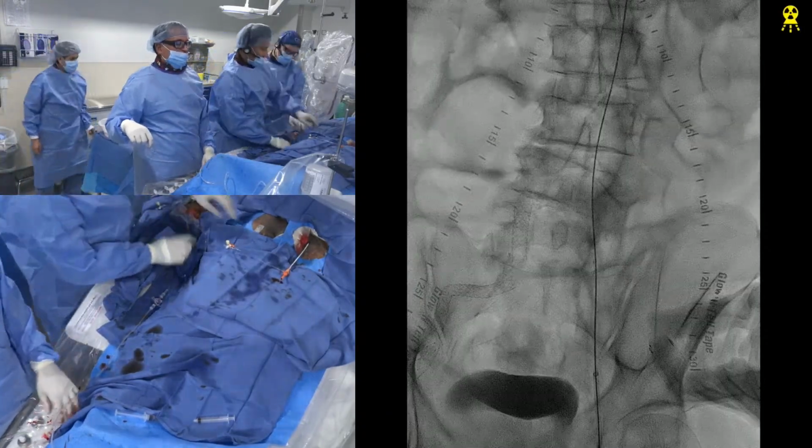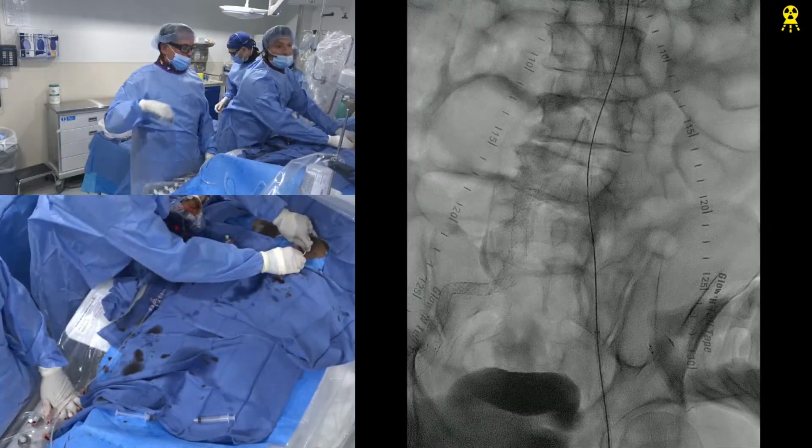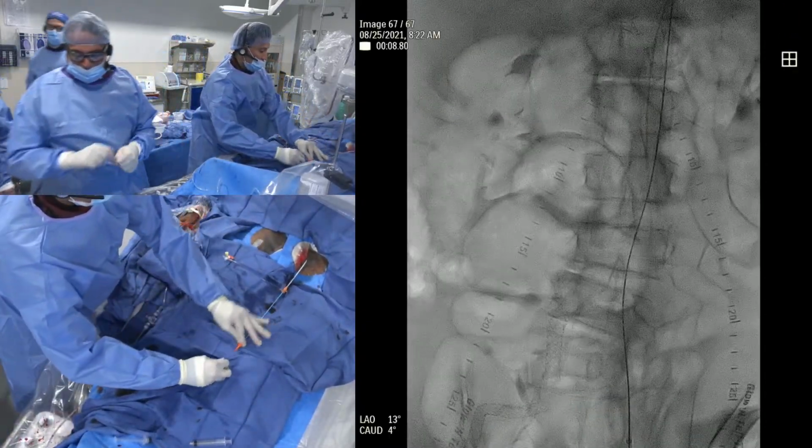Type that down, please. I kept a loop this time here. 25? So even if you pulled it, that's good, right there. Walk out the dilator. No more dilator. All right. That's okay. All right. So now we're going to go back again with this.